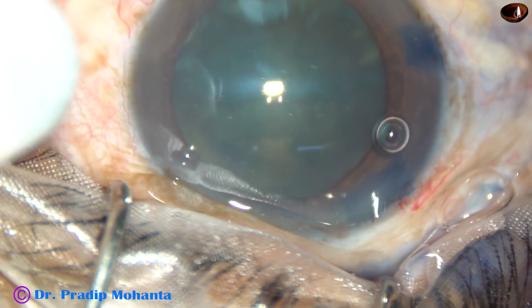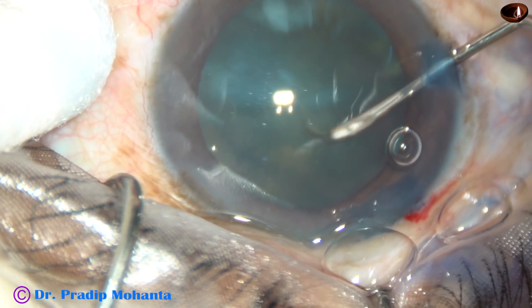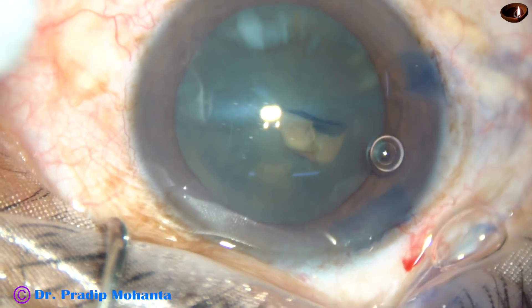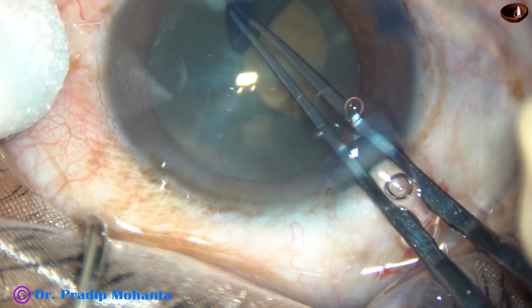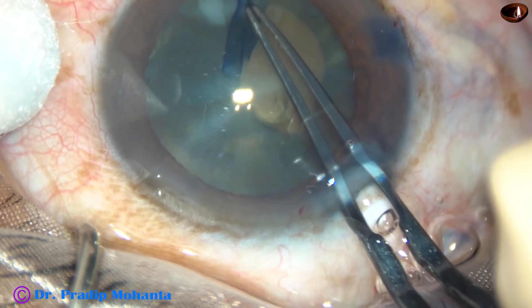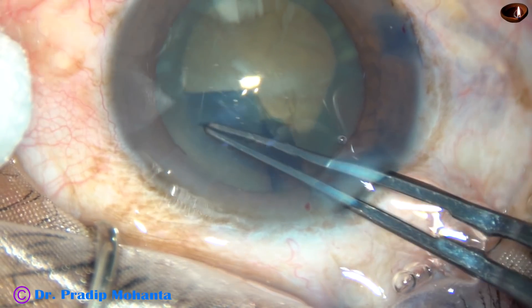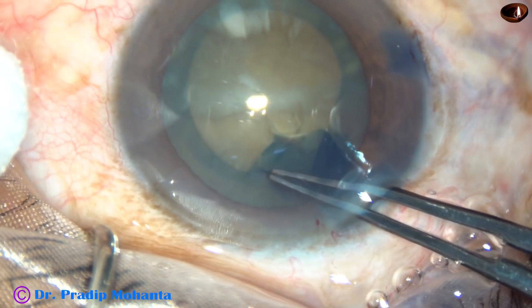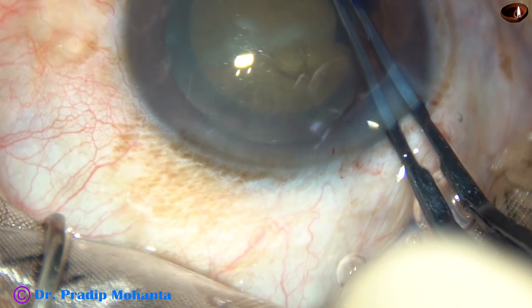And now, capsulorhexis. I incise the capsule with a 26-gauge bent needle, raise a nice big flap, hold this capsular flap with the Utrata forceps, go anticlockwise, remain at a certain distance away from the margin of the dilated pupil, and thus complete a continuous curvilinear capsulorhexis.